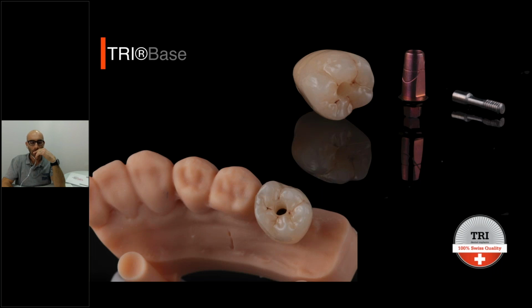This composite color provides not only the aesthetic, but also increases a little bit the strength of our restoration, because we apply real composite. It is not like a liquid color. It's a little bit more sticky, and it increases a little bit the flexural strength of our provisional restoration.